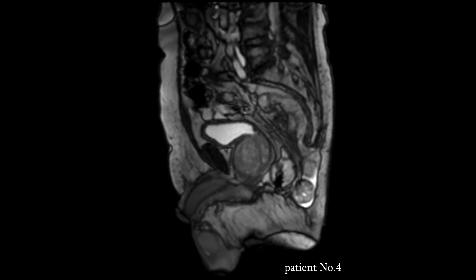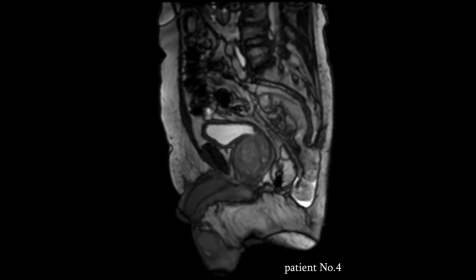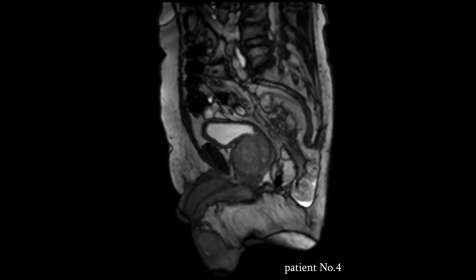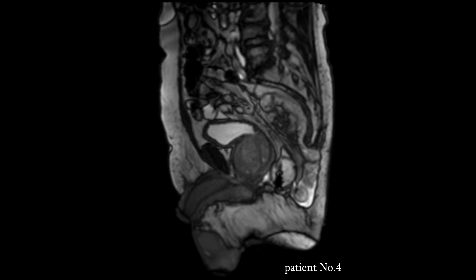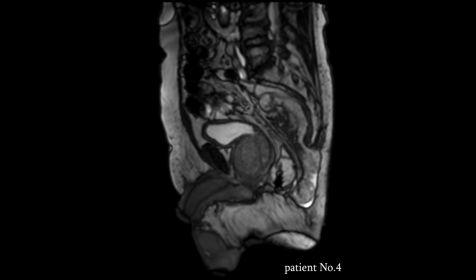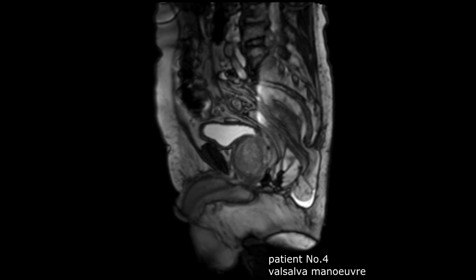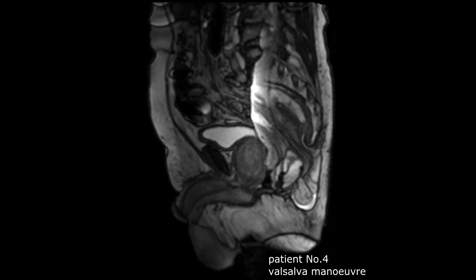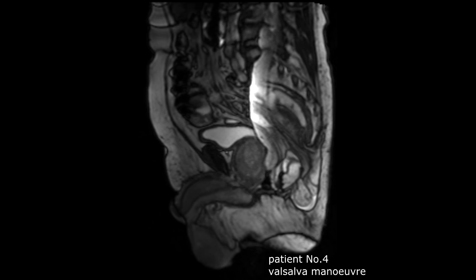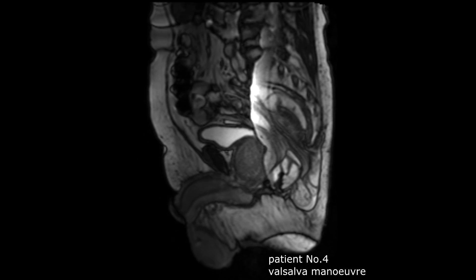This video shows a perineal hernia through a pelvic floor defect after an extra levator abdominal perineal excision of rectal cancer. These MRI views are recorded at rest. During the Valsalva manoeuvre, a further herniation of small bowel into the perineal defect is noticeable.